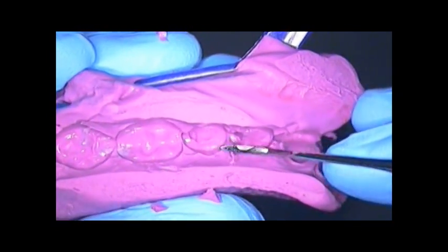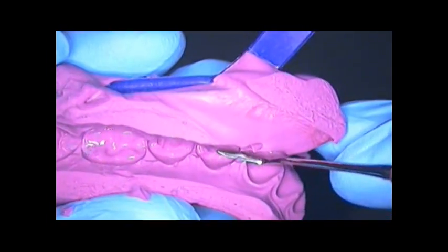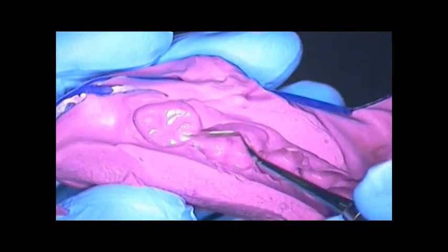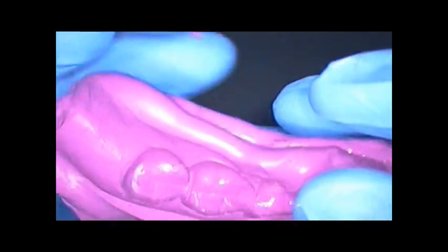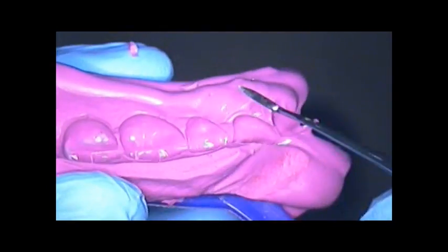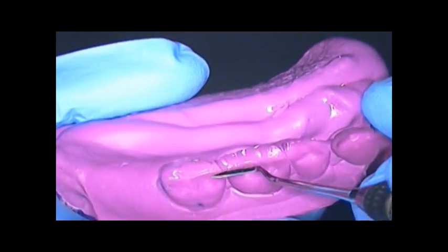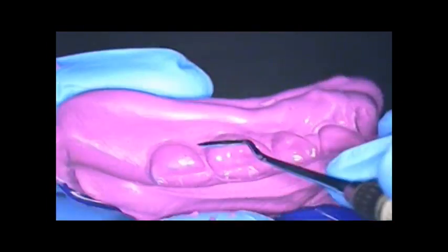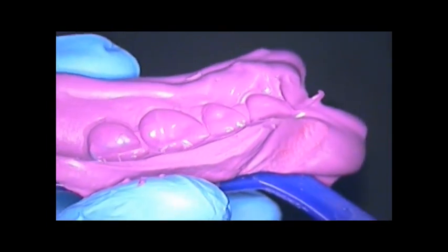We will be pouring this impression with snapstone. I have 3 bowls that I'm going to have ready with about a quarter scoop of snapstone in each, and I'll pour into the impression. This is after the patient's dismissed. I'll pour right into the impression, and I use a system called WOW. I don't have it here to show you, but I will next time when we go to seat the crown. I'll show you what that looks like. I give that bite alginate a pour up on both sides, mounted within this self-contained articulator. That goes to the lab, and then they have that.